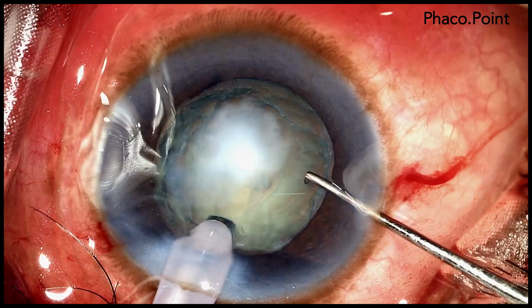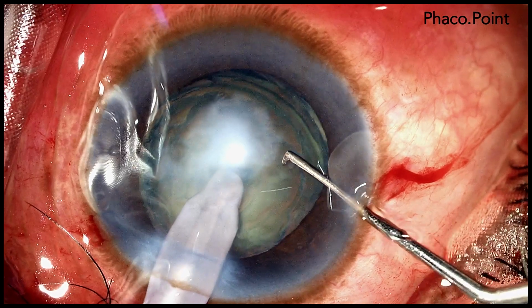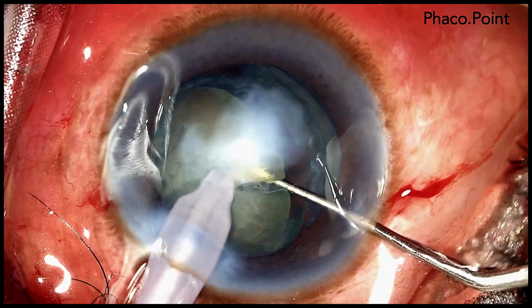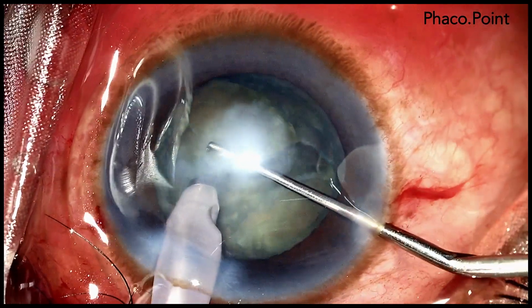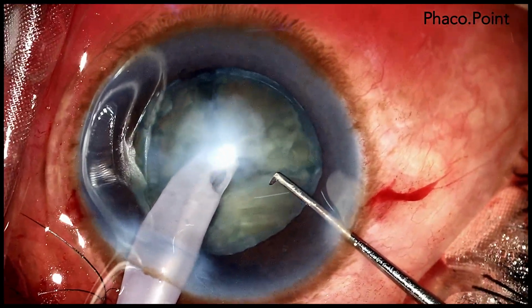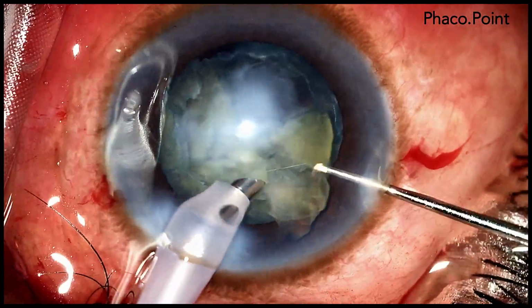Moving on with the case, as I impale into the nucleus and get a good hold of it, I'm able to actually elevate this soft endonucleus out of the bag. And I think in a patient with a corneal opacity where you've got a compromise on visibility, elevating the endonucleus out of the bag prior to chopping it and emulsifying the fragments is a good idea. Largely because your chances of then damaging the posterior capsule because of limited visibility are minimized.